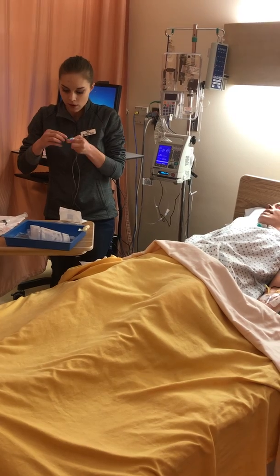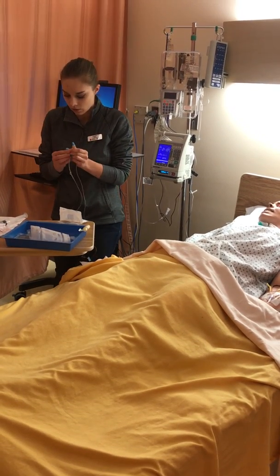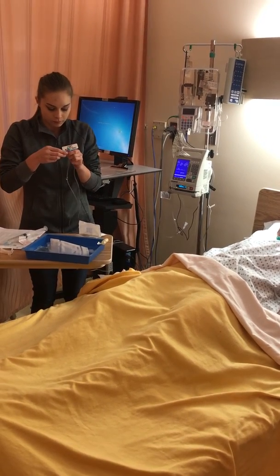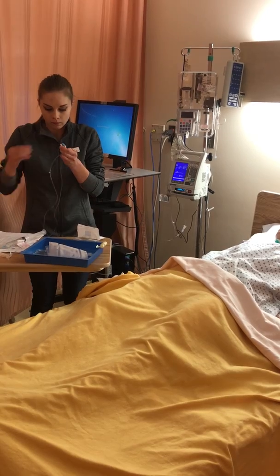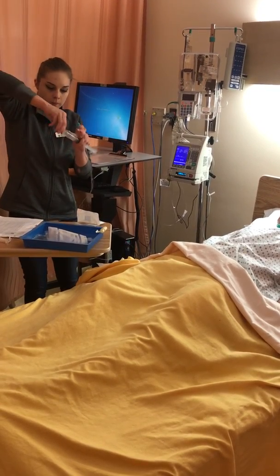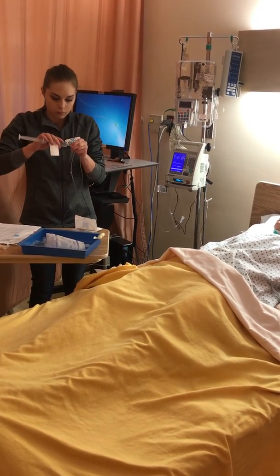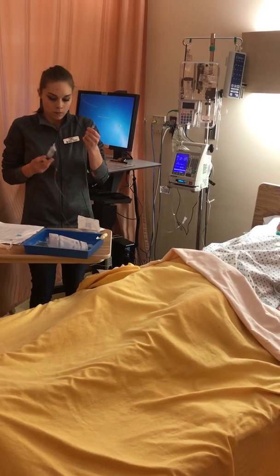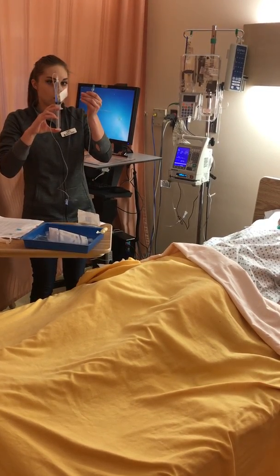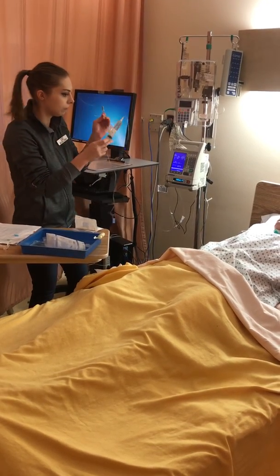I'm just going to loosen my tops a little bit. Careful not to touch. I didn't do my first check. Here we are.